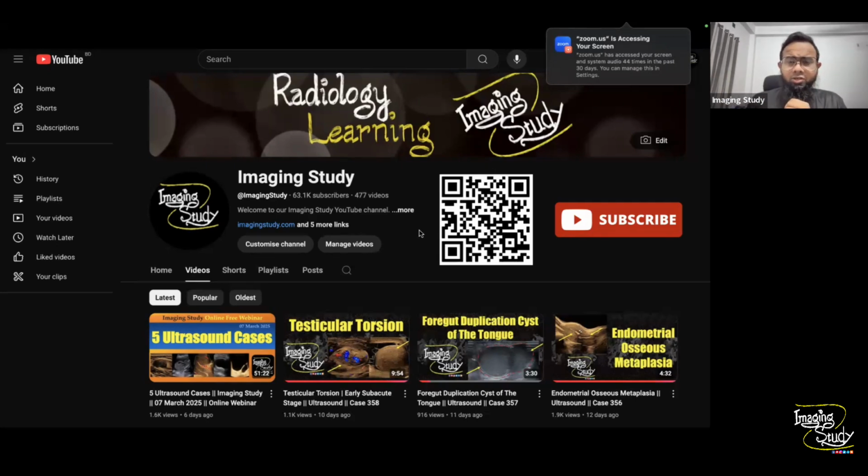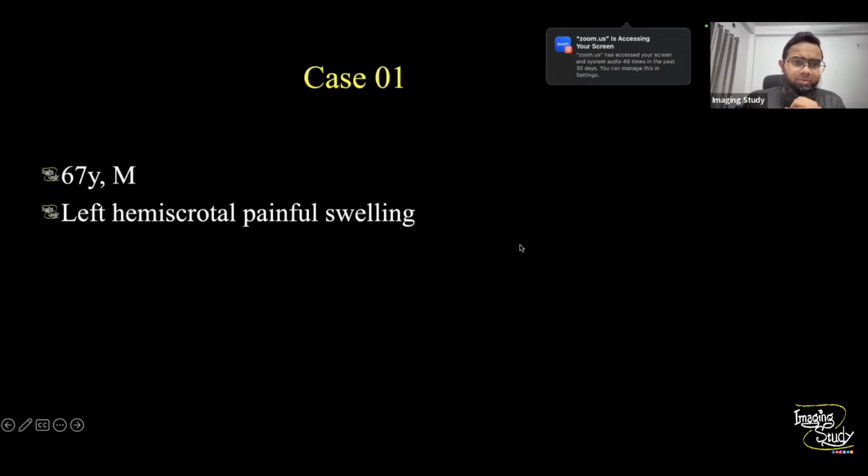Anyway, let's join our first session today. Today, as before, we'll discuss 5 cases, and hopefully some of them may be helpful for you. So let's start with the first case.